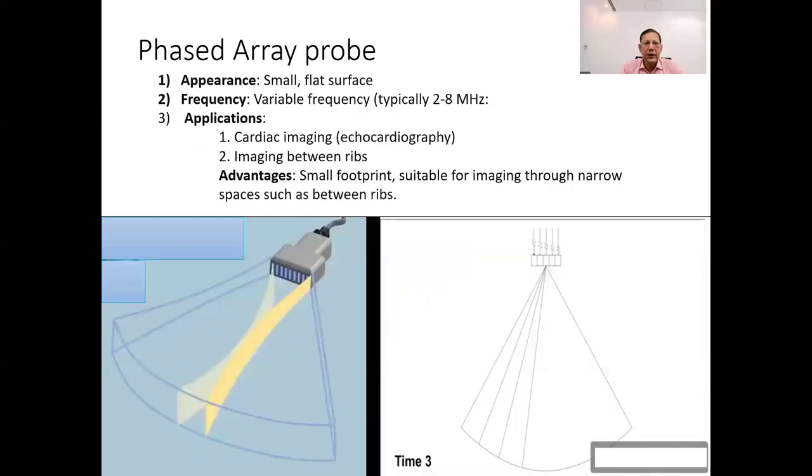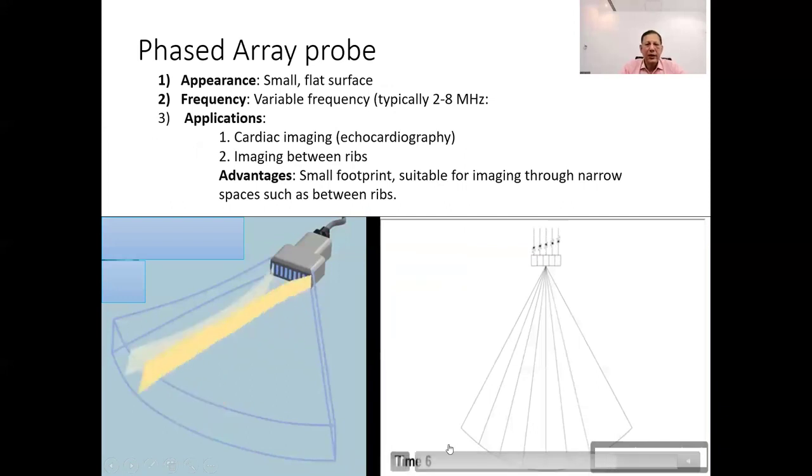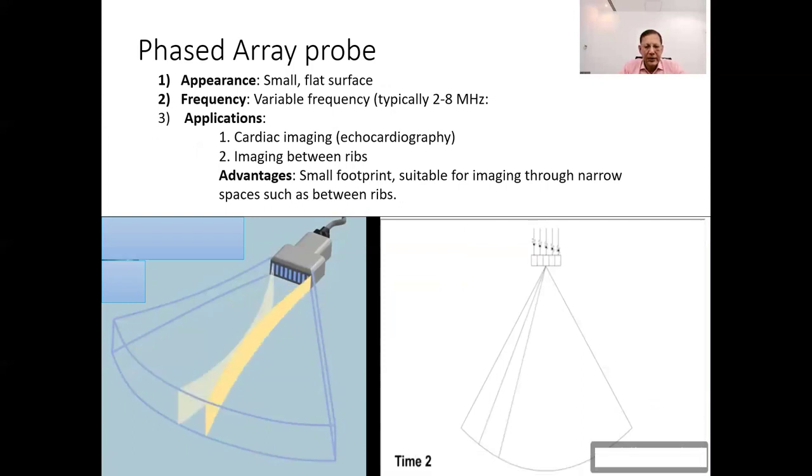Next transducer that we will study is the phased array transducer. These are used in medical ultrasound imaging to produce detailed images of internal organs, tissues, and blood flow. They allow for real-time imaging and can provide high-resolution images of structures at various depths without moving the transducer.